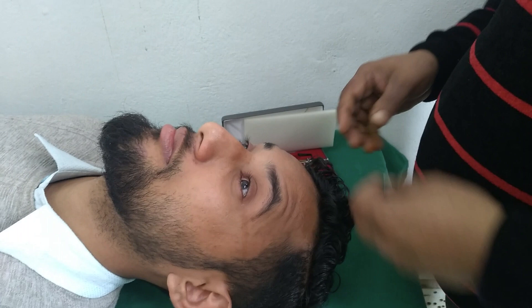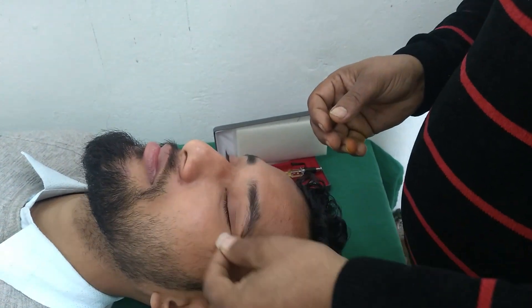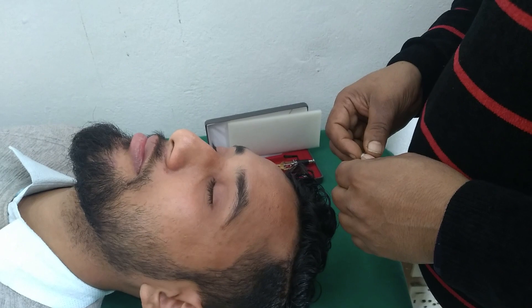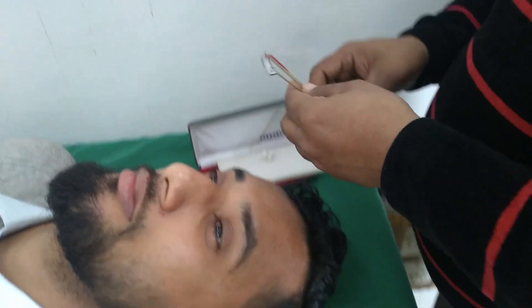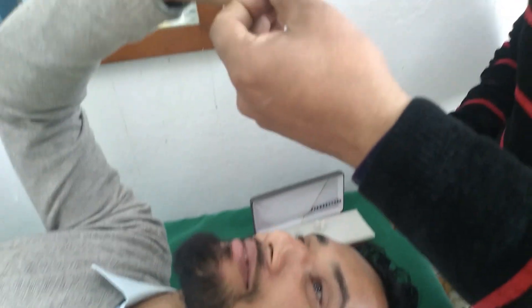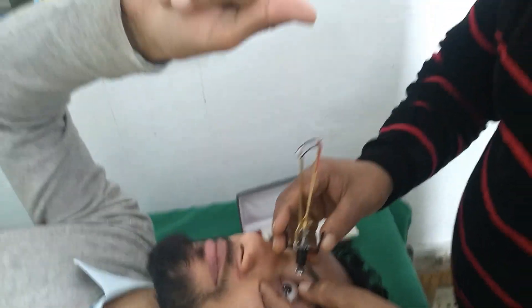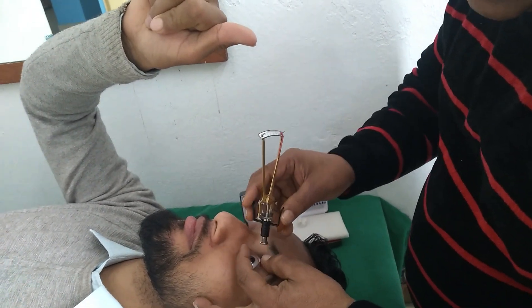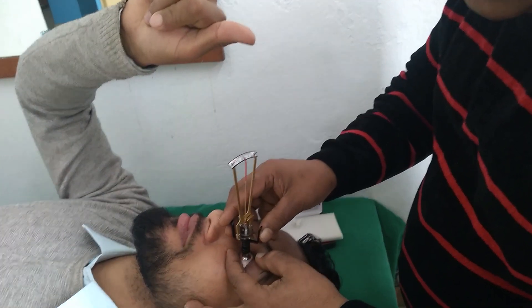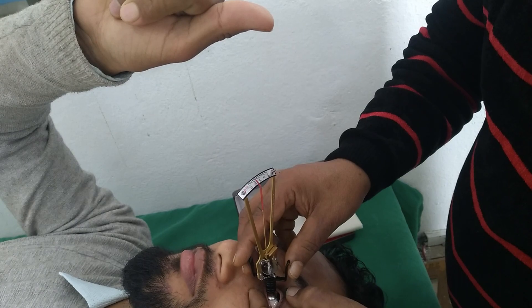Ask the patient to keep his vision fixed at one point — here he is asked to fix his vision on his thumb. The examiner separates the eyelid with his left hand and gently rests the foot plate of the tonometer on the center of the cornea. The reading on the scale is noted as soon as the needle becomes steady — reading: 5.5.